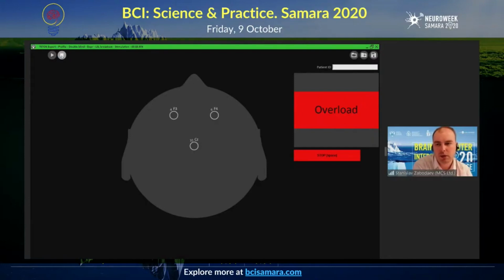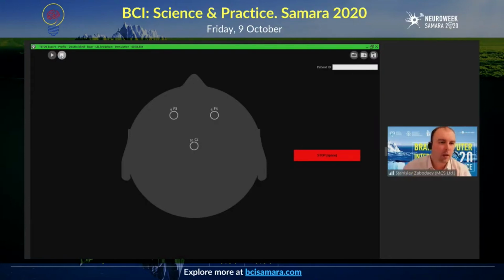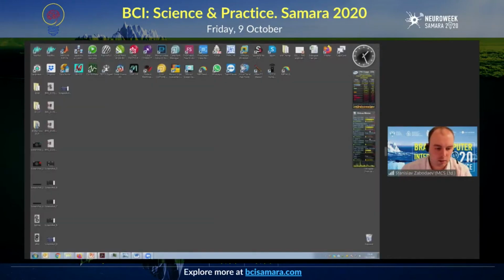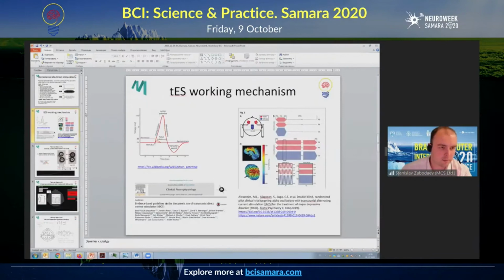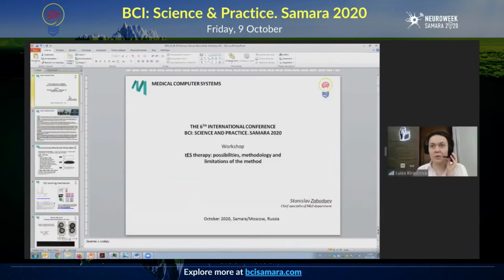I click off the CZ electrode. If it was not well connected, you will see that alarm. I basically ran out of time. It's 5 minutes left until the end of the workshop. I don't want to hold on too much of your time, and I will be ready to take your questions.